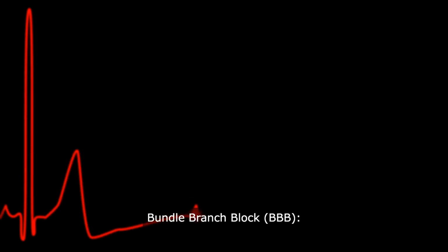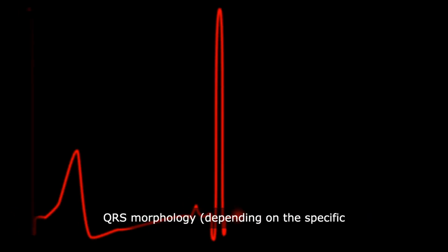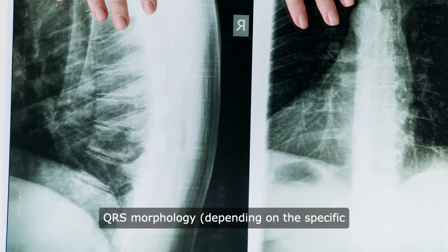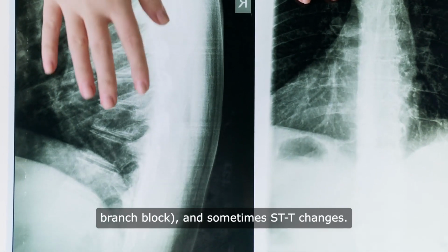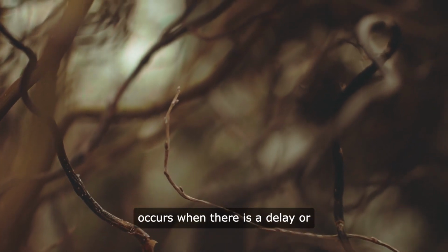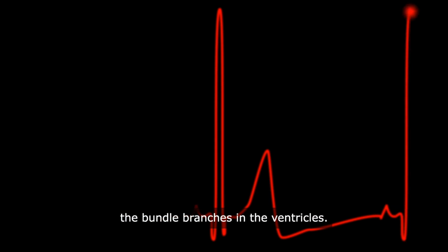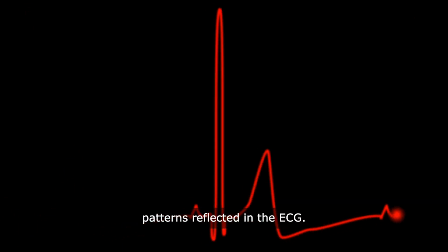Bundle branch block, BBB. ECG changes: widened QRS complex, greater than 0.12 seconds, altered QRS morphology depending on the specific branch block, and sometimes ST-T changes. Explanation. Bundle branch block occurs when there is a delay or blockage of electrical impulses along the bundle branches in the ventricles. This results in altered depolarization patterns reflected in the ECG.